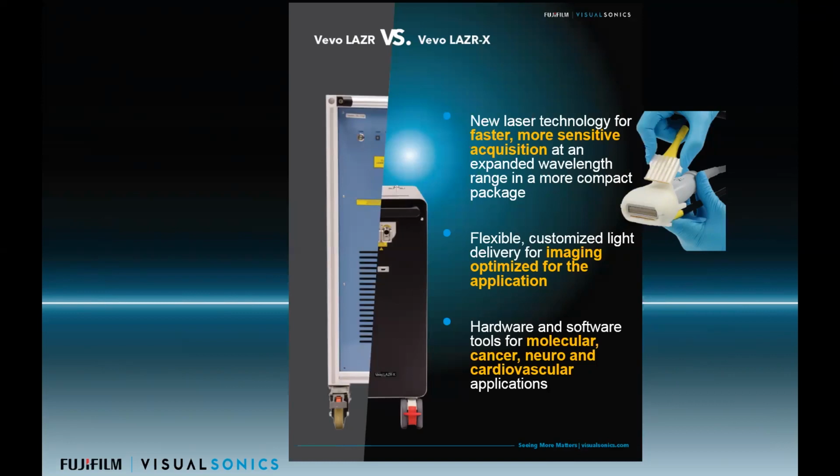And then we've also integrated a lot of hardware and software tools for doing different kinds of applications. I'll talk about the applications in the next slide, but really integrating things like the UI for our injector pump, so you can do remote injections, and integrating tools for doing phantom imaging, so you can characterize photoacoustic contrast agents. These are all part of the Vevo LAZR-X system, which do not exist on the 2100 system or the Vevo LAZR.